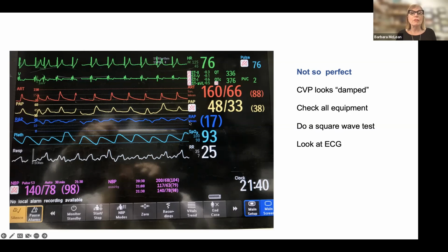That's reflected back to the RV and ultimately reflected to the RA. Very likely that the patient's arterial volume is low and his venous volume is high. He's gained weight. He has interstitial edema. He might even need CRRT. I can't find an A wave well-defined here because it looks like a junctional rhythm, but I do have this evaluation here that tells me that the right ventricular filling pressure, which is reflected in the right atria, is of concern.